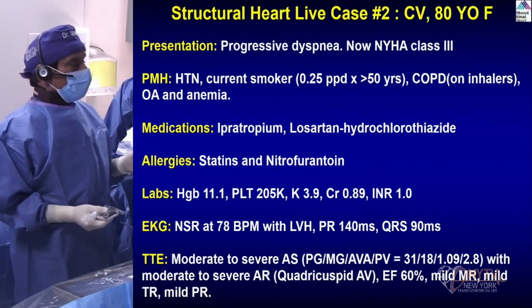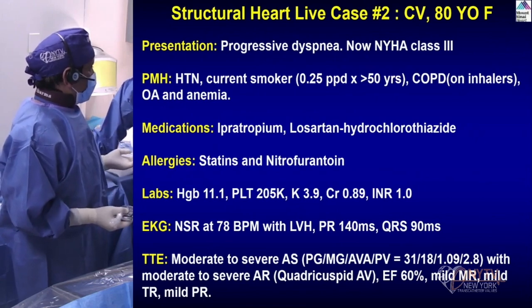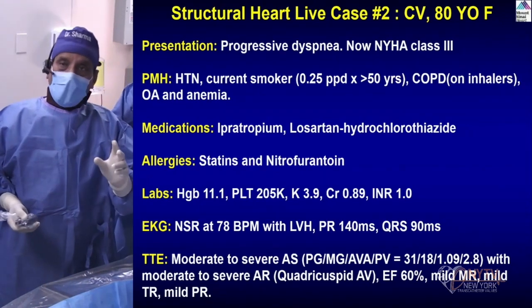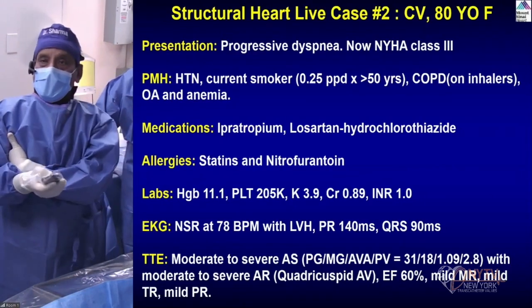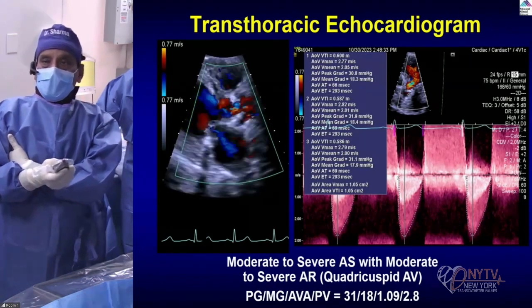I don't know, maybe we'll ask somebody. We actually had one unicuspid valve at one time. I don't know the incidence of quadricuspid. I have not seen one in my career. I have seen one unicuspid. Bicuspid, tricuspid, forget it. But we had one unicuspid about 10 years ago. And this is the quadricuspid.